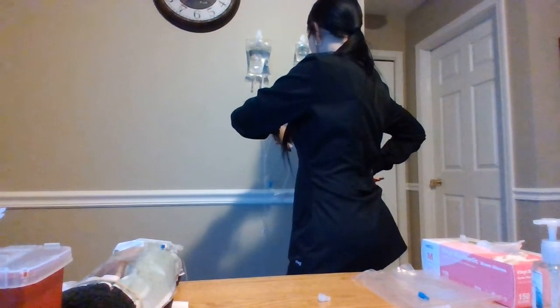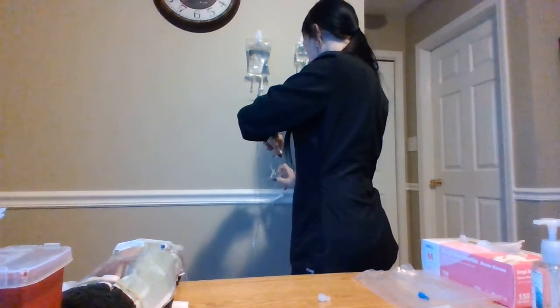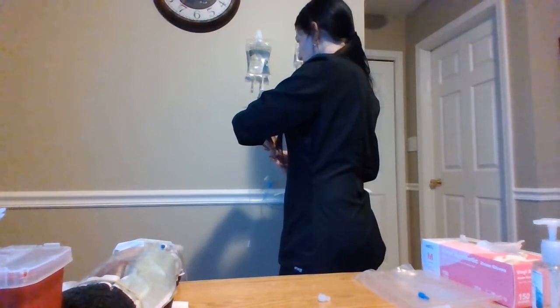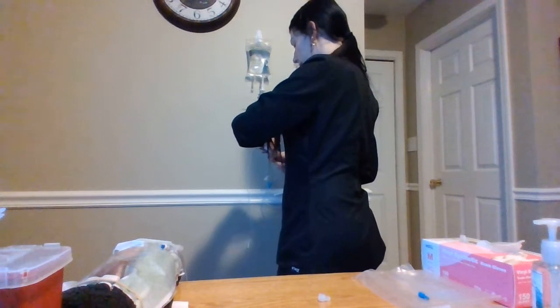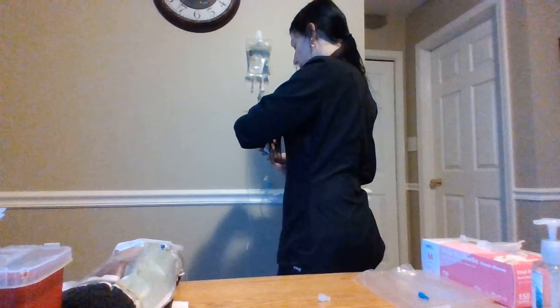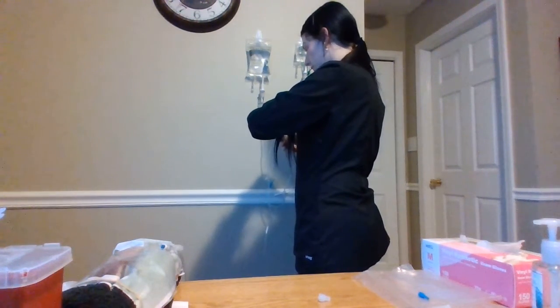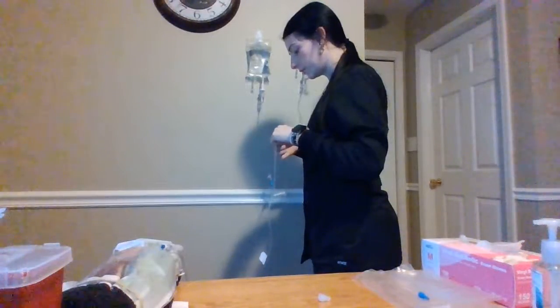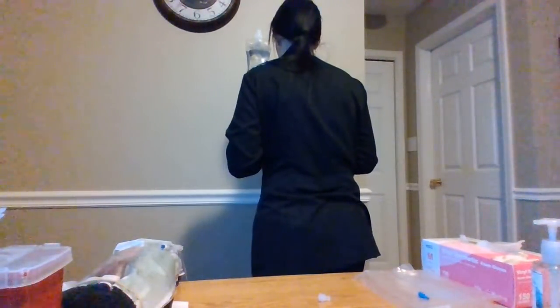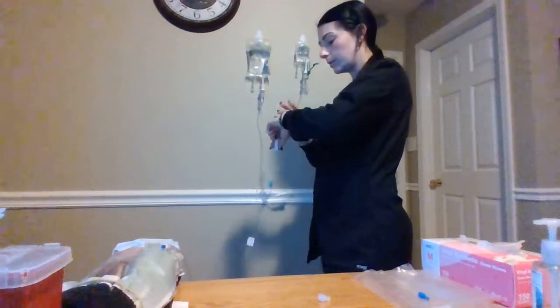1, 2, 3, 4, 5, 6, 7, 8, 9, 10, 11, 12, 13, 14, 15, 16. All right, so I'm going a little bit fast. I'm going to adjust my rate. And I'm going to restart counting.